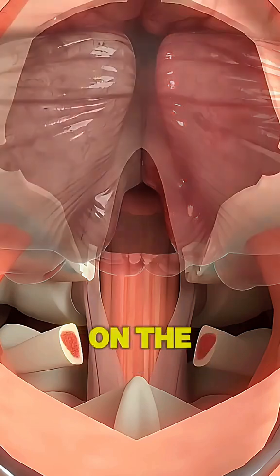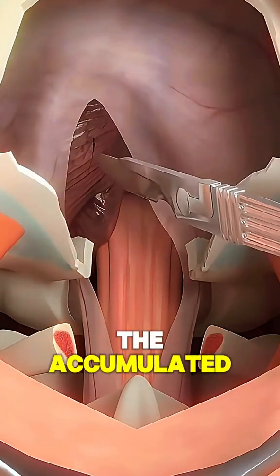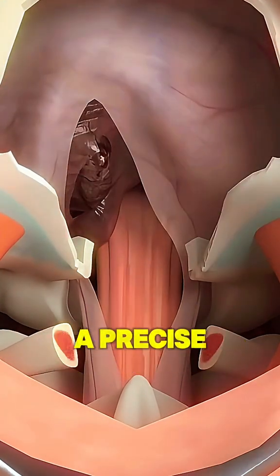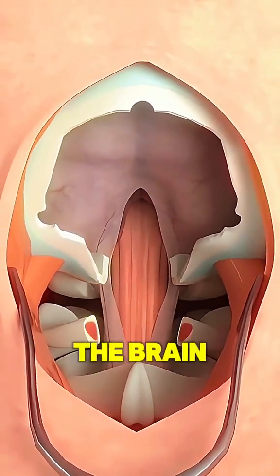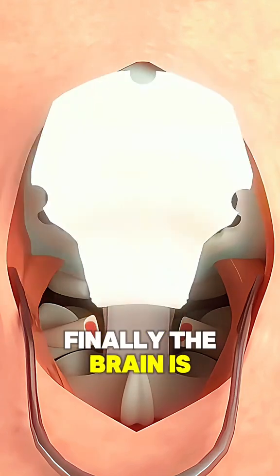After making an incision on the muscle layer, the accumulated blood becomes visible. A precise cut is then made on this blood clot to remove it from the brain. Finally, the brain is closed up.